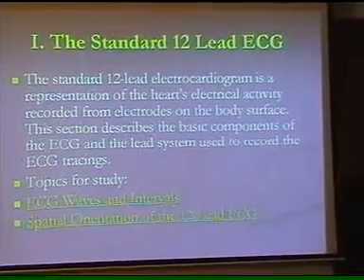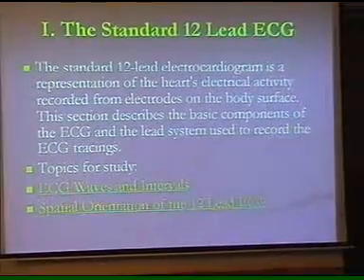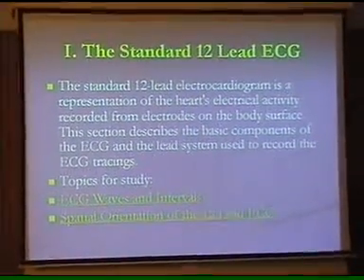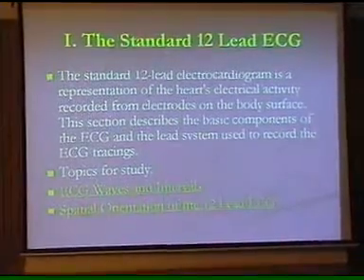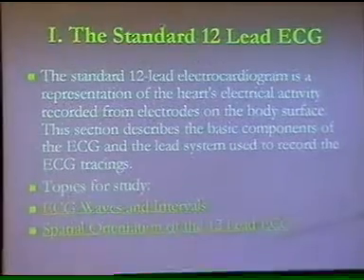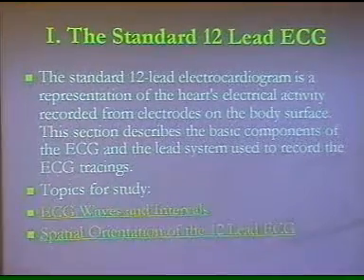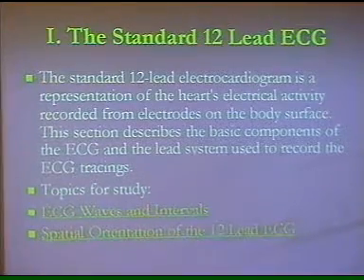What I understand is that I have to take you through the basic ECG interpretation skills, and then lead you on to common arrhythmias or common ECG abnormalities as you see in clinical practice. Is that right? So just to start off with the common ECG interpretation and then take you through to the common abnormalities that you'll be coming across in your practice.